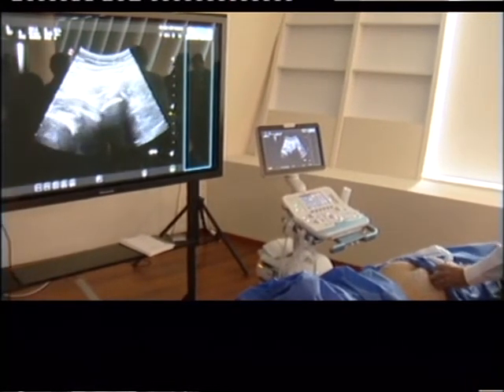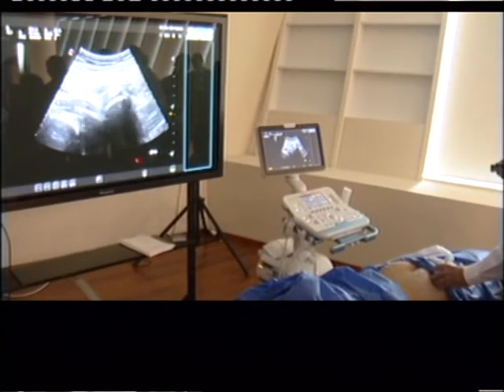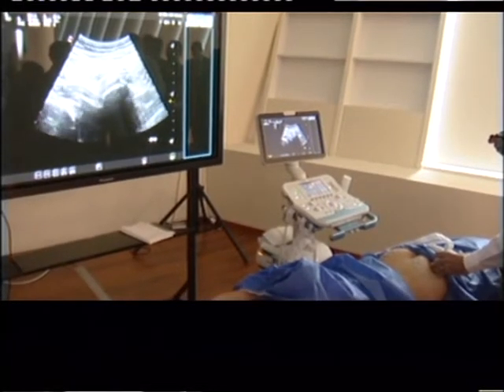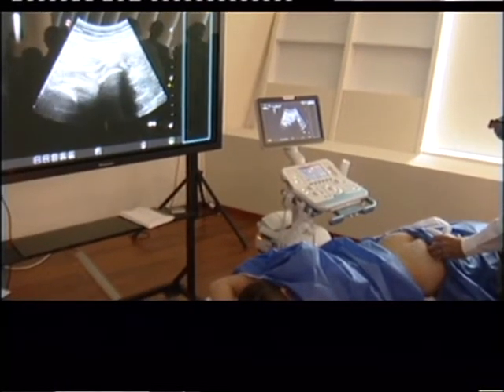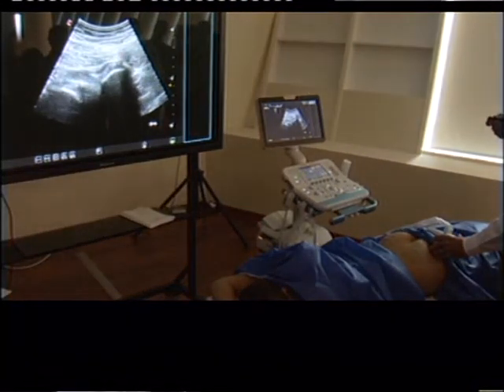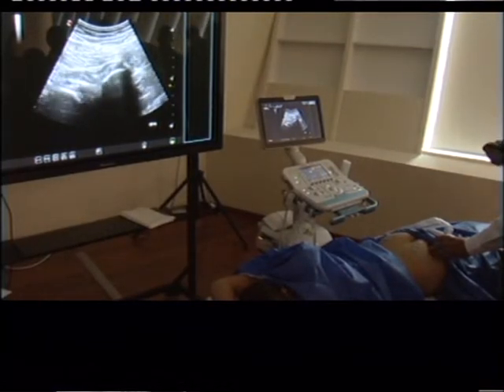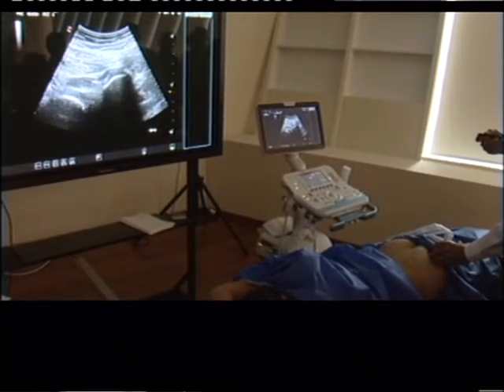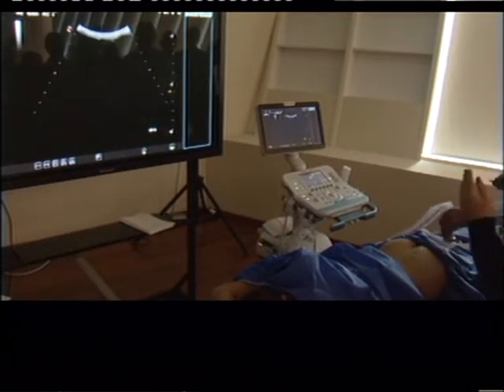But see, here's the other thing. Do you see? Here's the sciatic nerve, the conjoint tendon of the hamstring, obturator internus. So all three: sciatic nerve, obturator internus, hamstring. That's why it's so painful. Sciatic nerve, obturator internus, and hamstring, all in one picture. Okay, I understand.